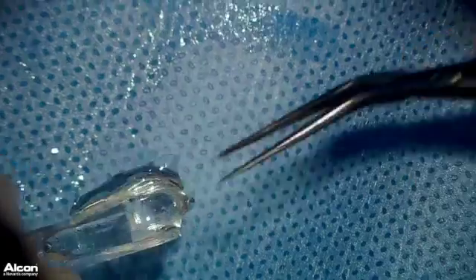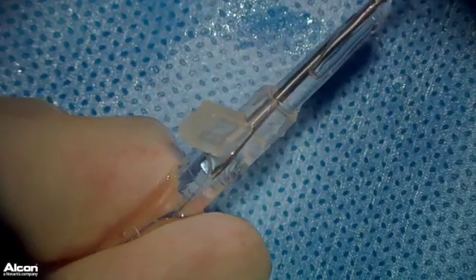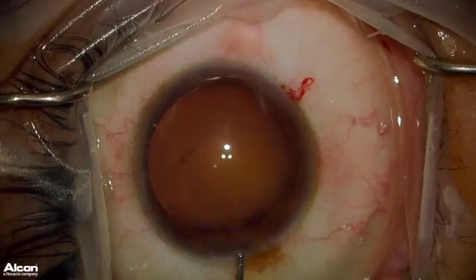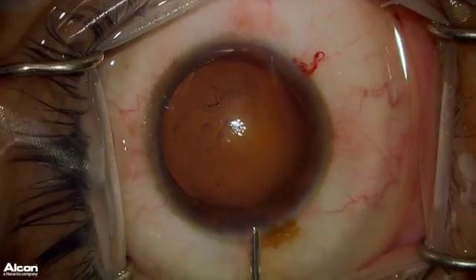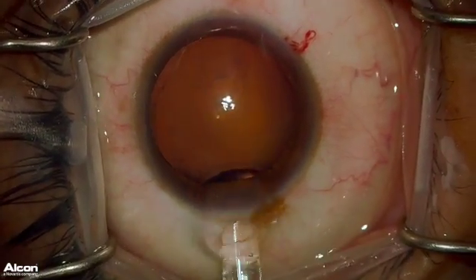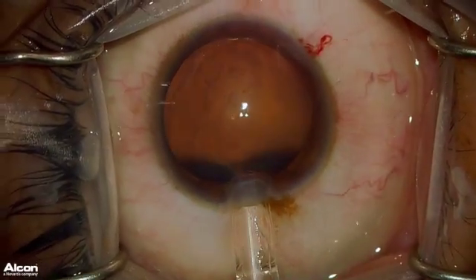Now you can take that same ICL and load it into the injector, as demonstrated here, just as you normally would. Pull it into the cartridge, adding some more OcciCote into the eye to make sure it is at the appropriate pressure for implanting the ICL. You can inject the ICL just like you normally do, as demonstrated here.